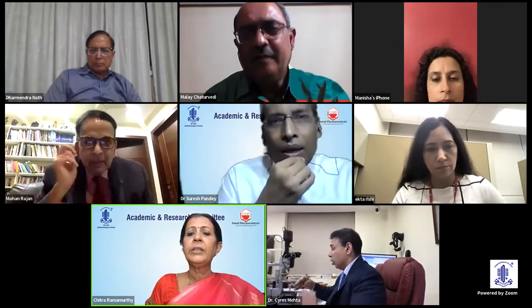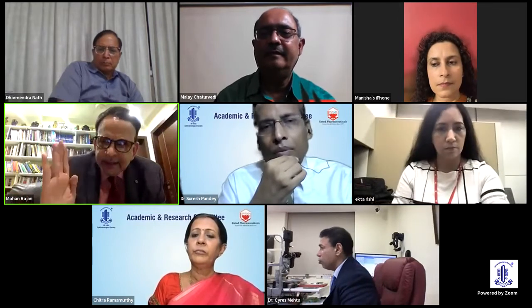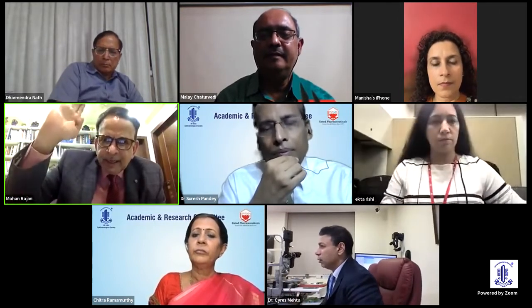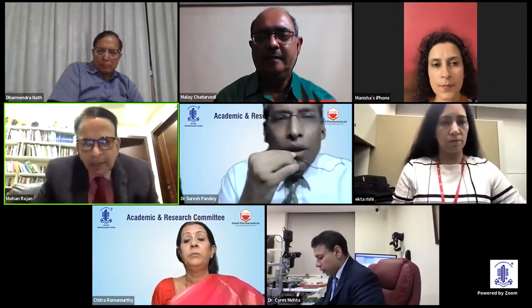Chitra, can I make a comment? Yes. I would agree with you because I've done a couple of kyphosis patients, wherein we just elevate the foot end of the patient. We stand back and elevate the foot end so that the legs, the feet, are vertically facing the ceiling, so that automatically the head end comes down. That makes life easy.